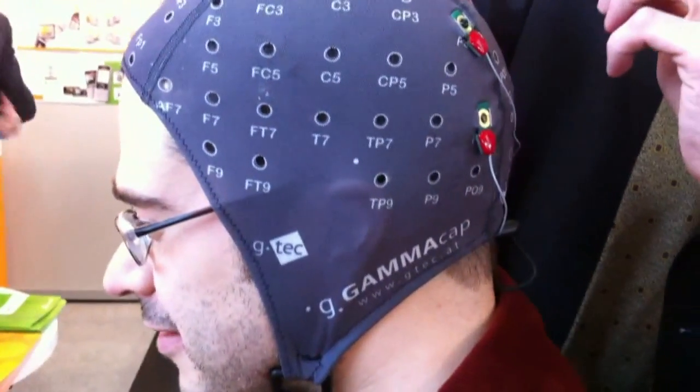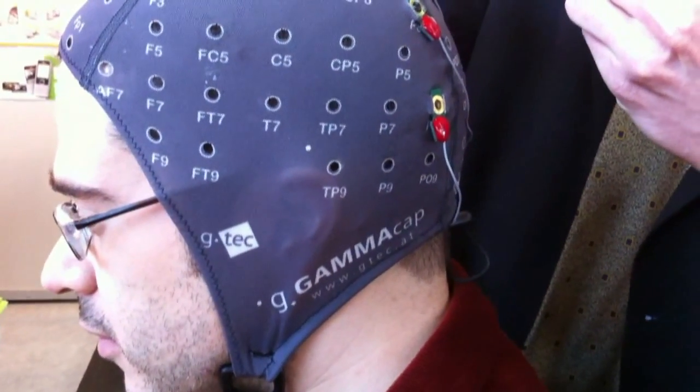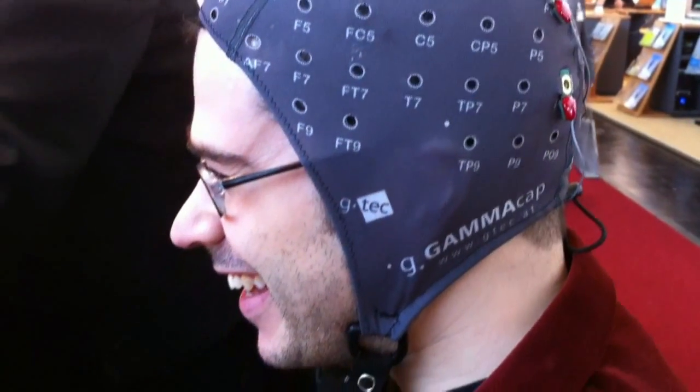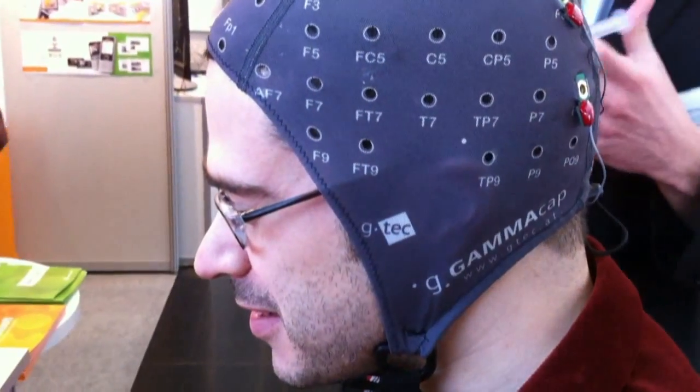I'm going to type with my mind. Takes about 10 minutes to set up. This isn't going to hurt, is it? It's going to hurt a lot. We also developed some dry electrodes which will be on market in a few weeks, so we don't even need gel anymore. I can feel the gel on my head — it's not so bad, not as cold as it is outside.